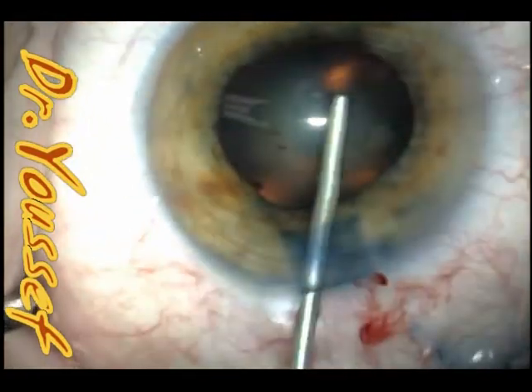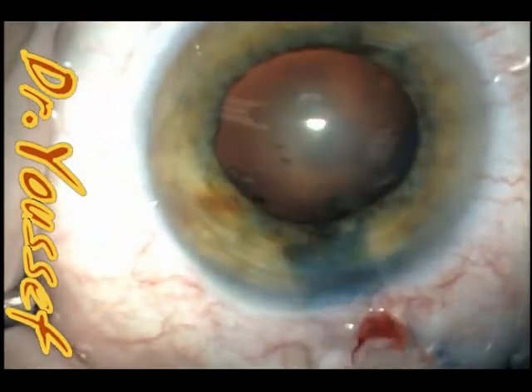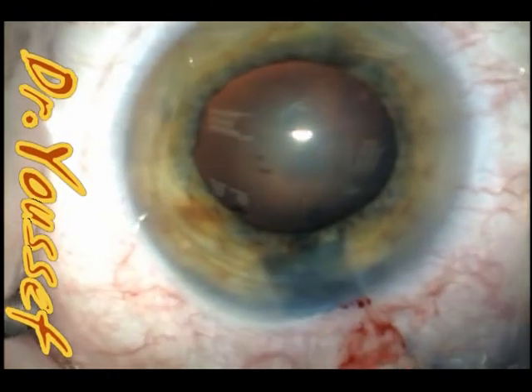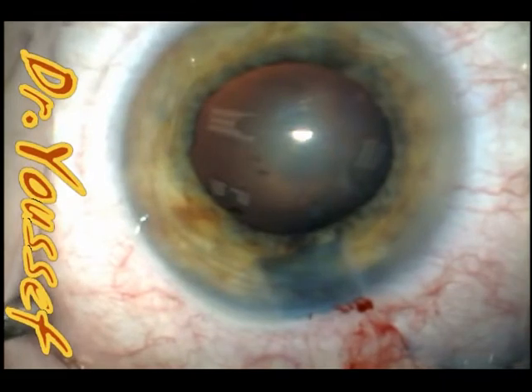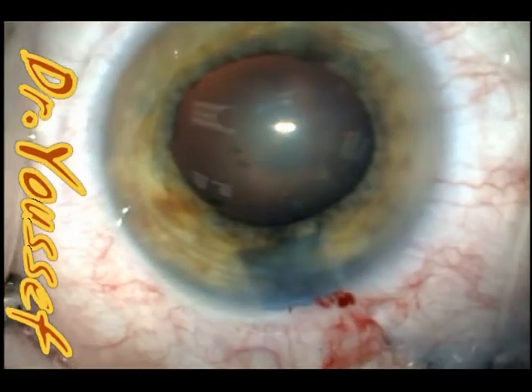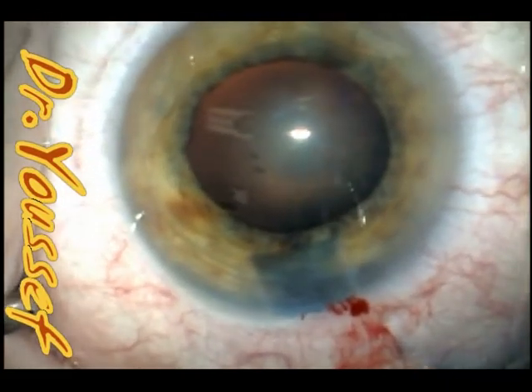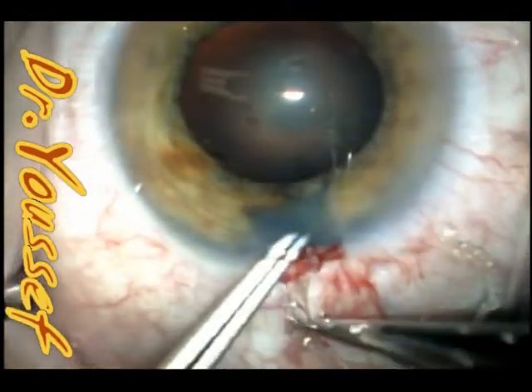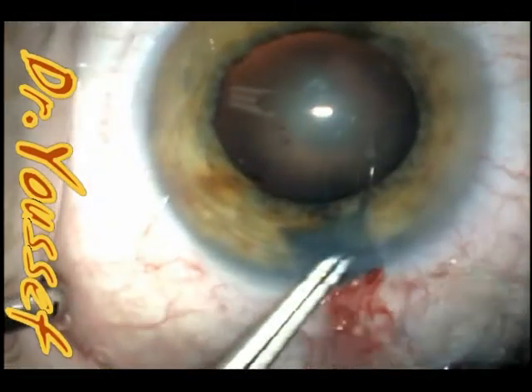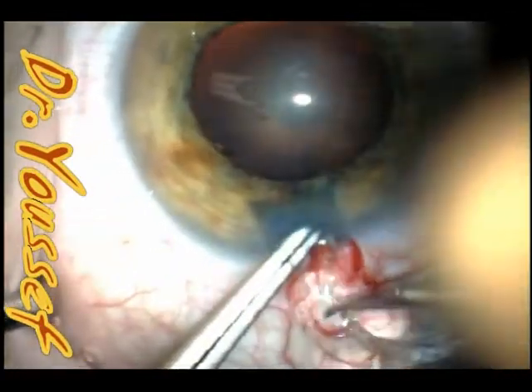After that, I'll inject the viscoelastic because some of it has been lost when you introduce something like the Beeler — you lose some outside and the chamber is already shallow. Sometimes we need to do a vitreous tap to try to deepen the anterior chamber, but I didn't need that in this case.